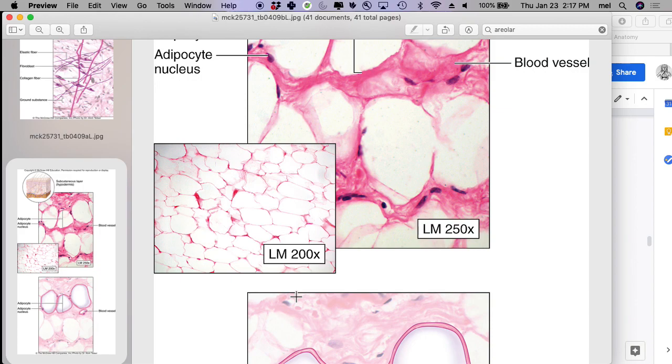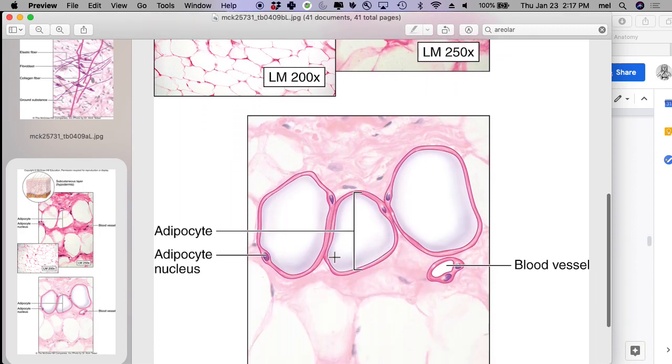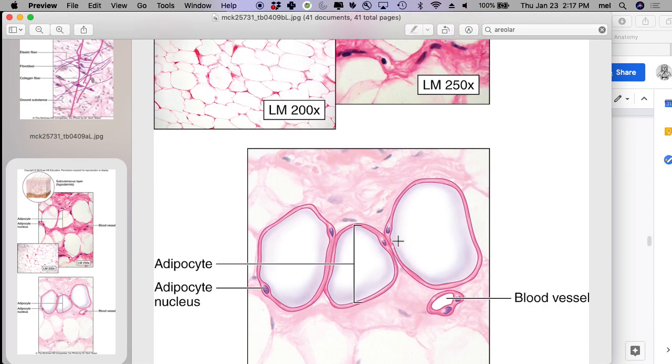Can you label the elastic fibers? No, you can't. Are there fibroblasts in there? Yeah, but they're smashed between things and you just can't see them very well. So when you actually look at it really up close, it's this tissue that's sort of cell. Does that make sense to you guys? That's why it's categorized as a loose connective tissue. So we have areolar, and we have adipose.